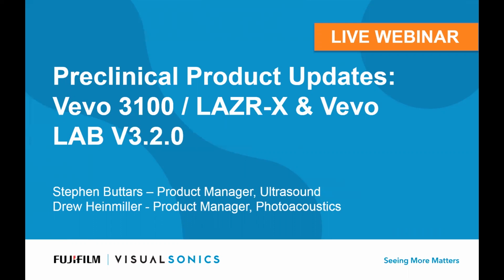So today, myself and Drew Heinmiller, who's another product manager here, will be going over some product updates focused on our version 3.2 release of software for the Vevo 3100 and LAZR-X system, and also for Vevo LAB. We've got some great new additions, changes, improvements, developments, and tools to talk about in this webinar.